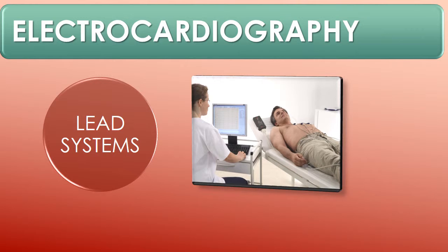An 80-lead EKG system looks at 80 views instead of only 12, and gives a 360-degree view of the heart. Evaluation with this 80-lead system revealed a 15% increase in diagnosis of MIs over the 12-lead system. So it is evidence-based. It's the newest thing.